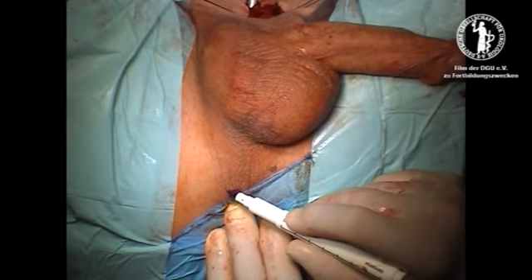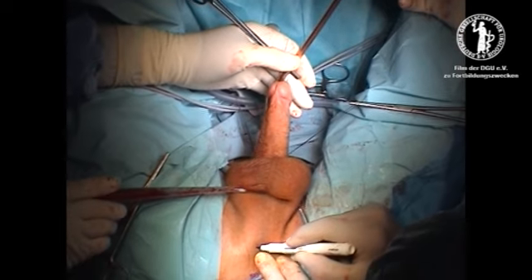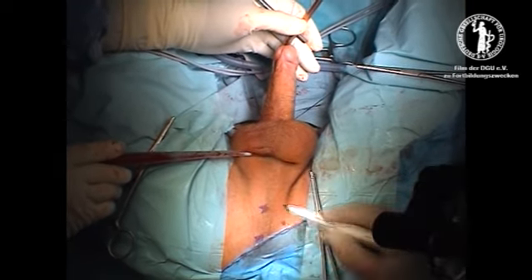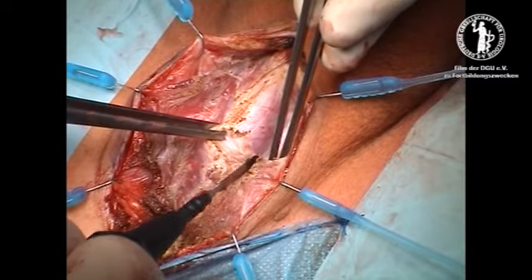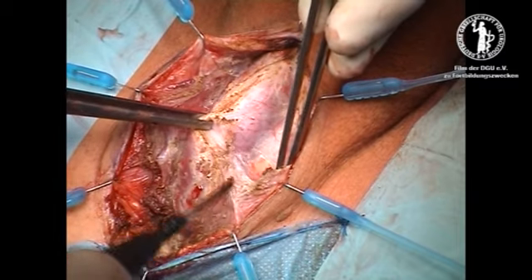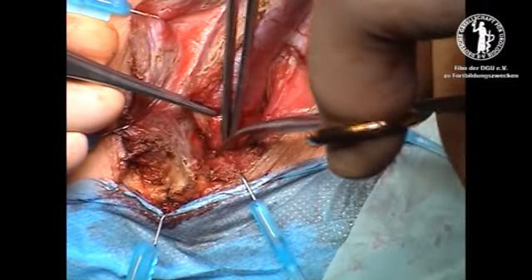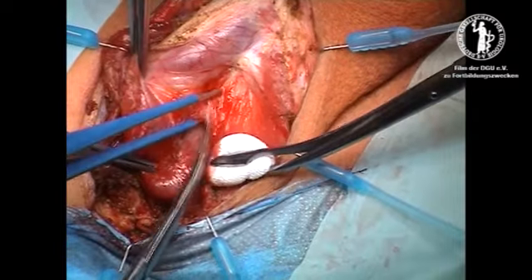A transurethral 20 French catheter is inserted in the distal urethra and the distance between the two ends is marked. Skin incision, division of bulbar muscle, and development of both urethral ends and mobilization of the distal urethra to get enough length for an anastomotic repair.